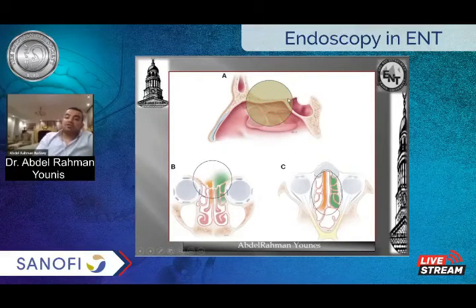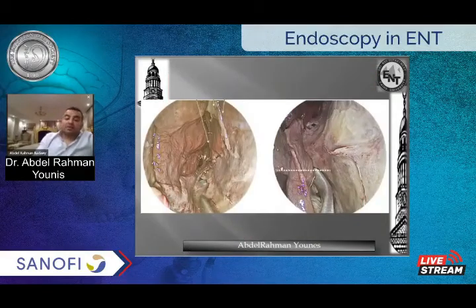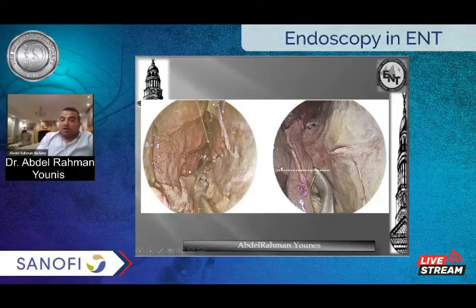So the first step of your surgery is to harvest that flap, as was mentioned by Dr. Oscar. It's a very good, tough vascularized flap. It depends on the posterior septal branch of the sphenopalatine artery. If you identify the sphenoid ostium, the sphenopalatine artery passes below the sphenoid ostium.